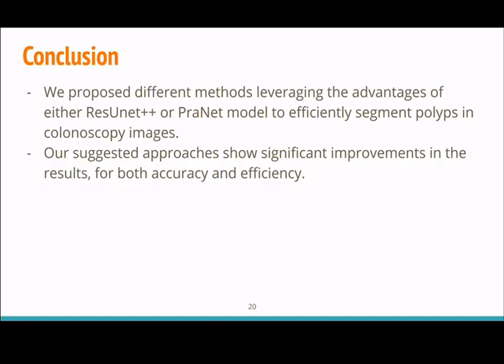The ResUnet++ one focused more on developing the model, adds multi-view triple path inputs, and pixel-based distance map prediction before getting the final results. As the experiment suggests, they each have their own strength, and this is why we shall develop a new version leveraging them both in the near future.